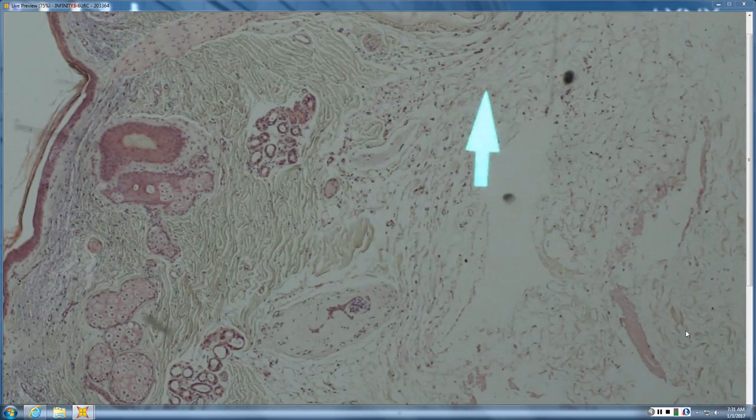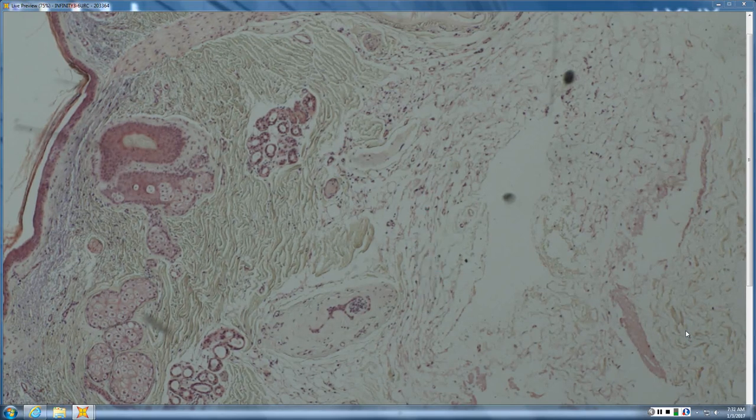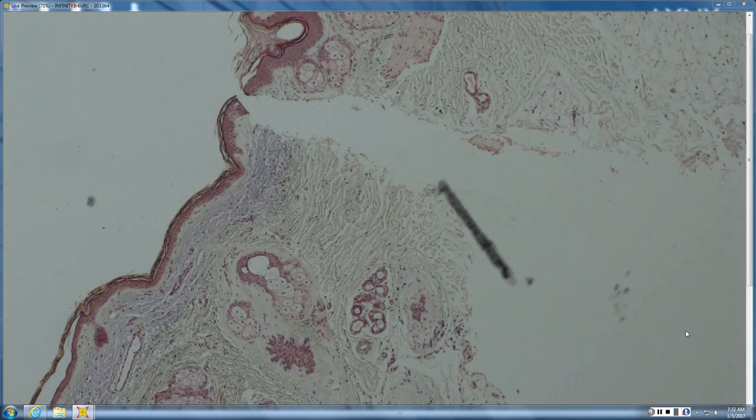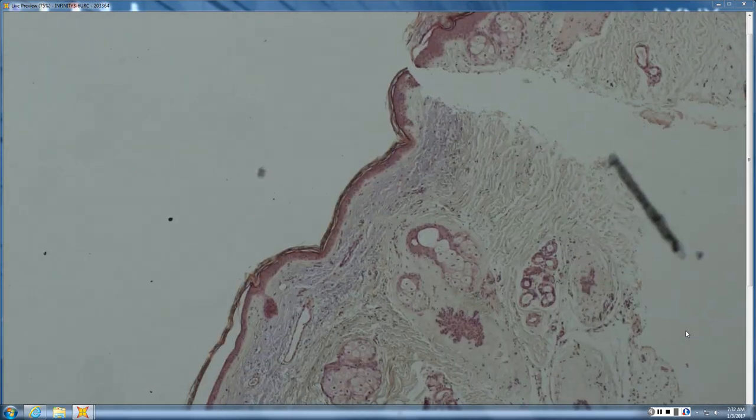What do you think about the size of the fat? Really small. Okay. You know, this pronounced lipoatrophy there. And then what kind of hairs do you see? Are those like dead reds in those? So there are dead reds, and the outside is all crinkled like that. So those are catagen. Right.